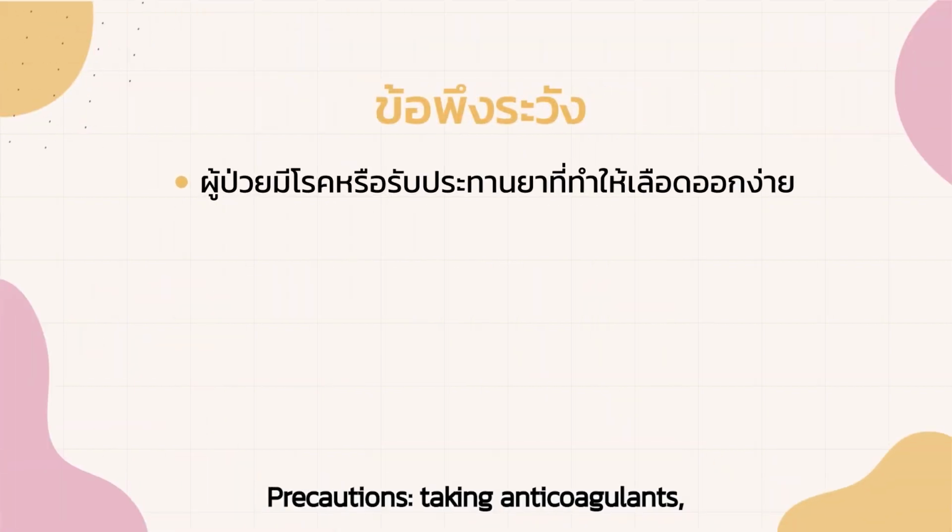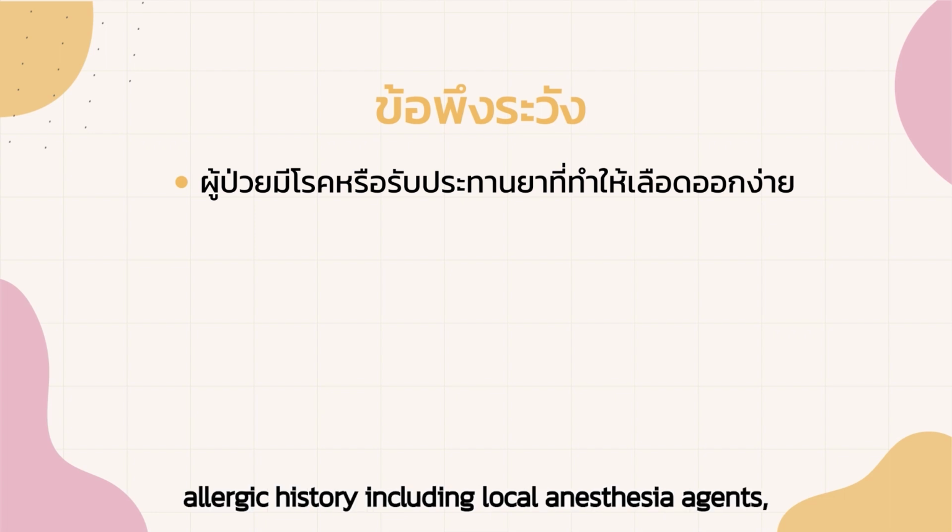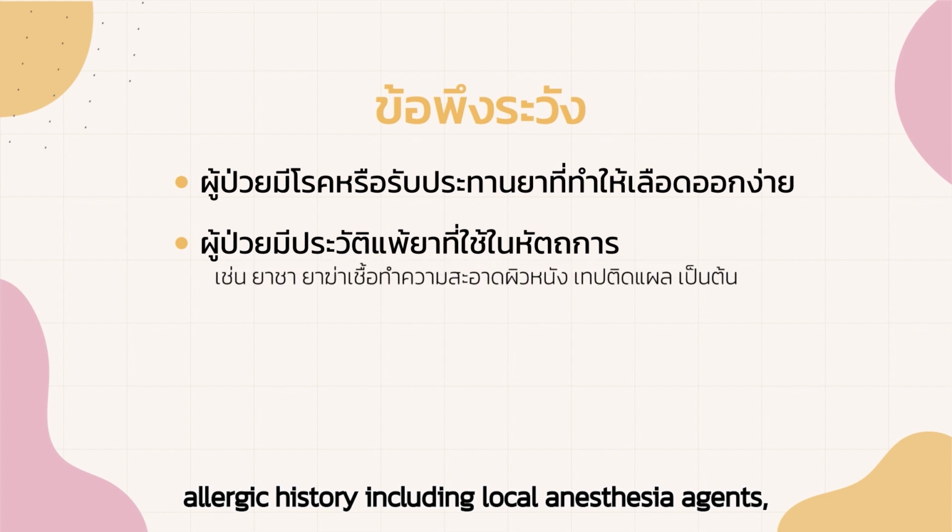Precautions. Taking anticoagulants, allergic history including local anesthesia agents, topical antimicrobials, and dressing tape.